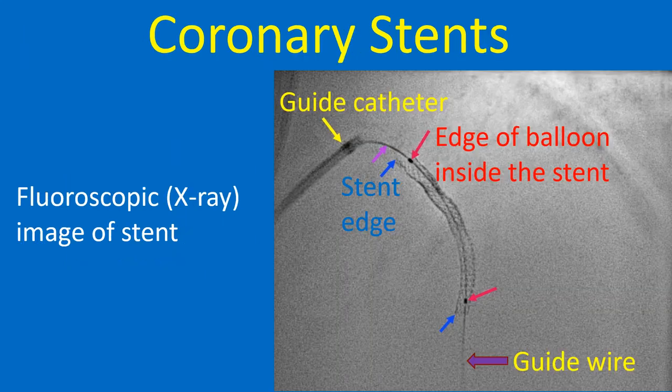Stents are tiny spring-like structures kept in folded position like a folded umbrella and expanded using a balloon while inside the blood vessel in the desired position. Stents are mounted on balloon catheters for introduction into blood vessel and pass through the guide catheter over the guide wire which was positioned during angioplasty.